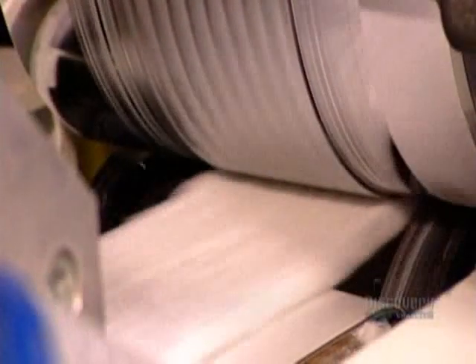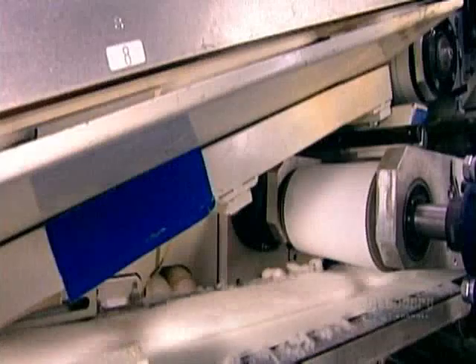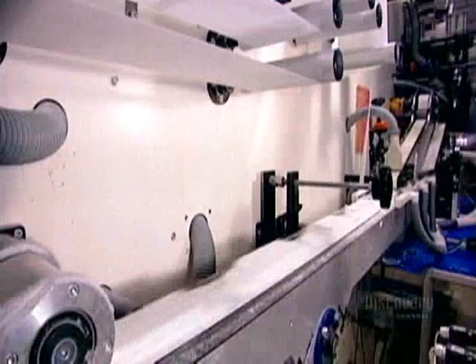This will be a 2-layer pad. The number of layers and their weight depends on the degree of menstrual flow a pad is designed to absorb. Now the machine's conveyor belts merge, bringing the 2 layers together.